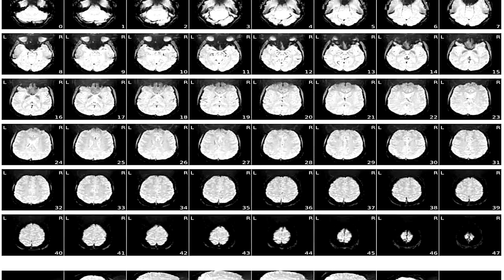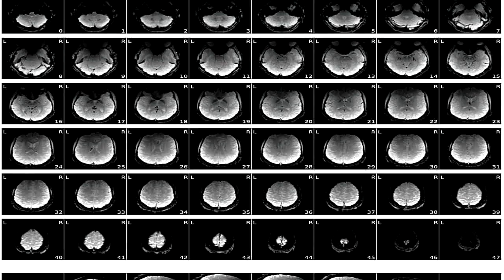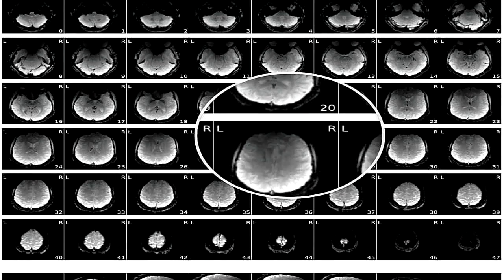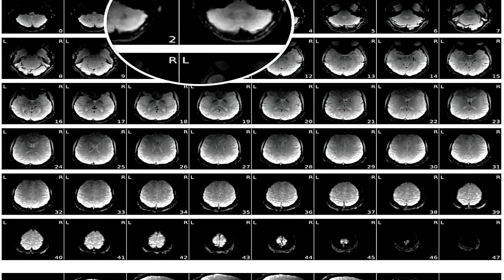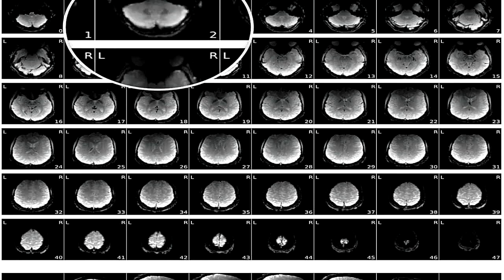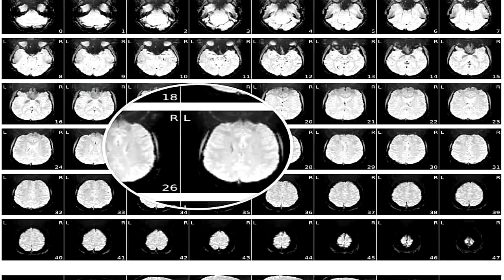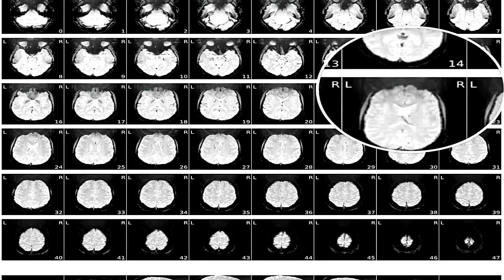And this is for fMRI. So this is an example without pre-scan normalization and with normalization. So this is without, and we can see how it's darker in the frontal. At some points, we don't have any signal. And then if you use the pre-scan normalization, it seems brighter. So you seem to have more signal there.